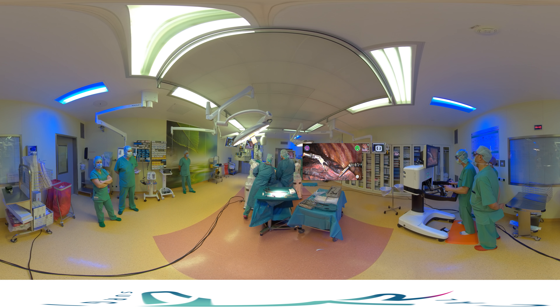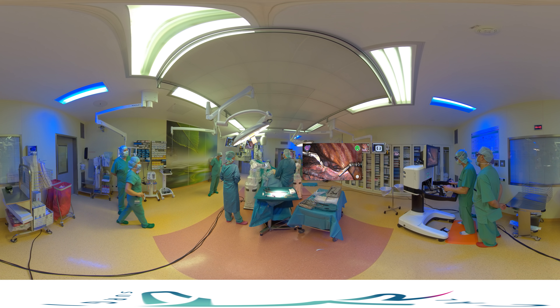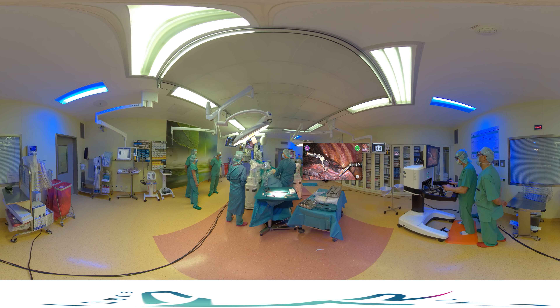You can now see the operation from a different angle. If you scroll to the right, you will see the surgeon's console. Thanks to the open screen, we can communicate effectively with the rest of the team and we can also allow students or observers to watch the procedure next to us, like in this situation.